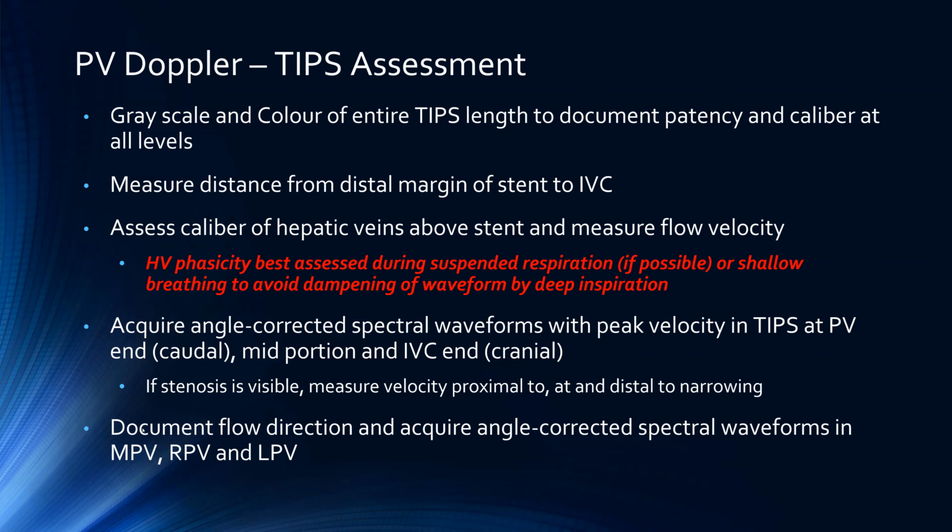Aside from that, flow direction should be acquired with, again, angle corrected spectral waveforms of the main right and left portal veins. So I know it's quite an extensive vascular assessment, but generally we don't do many of these. So for the infrequent times that we do them, we should be doing them in this way.